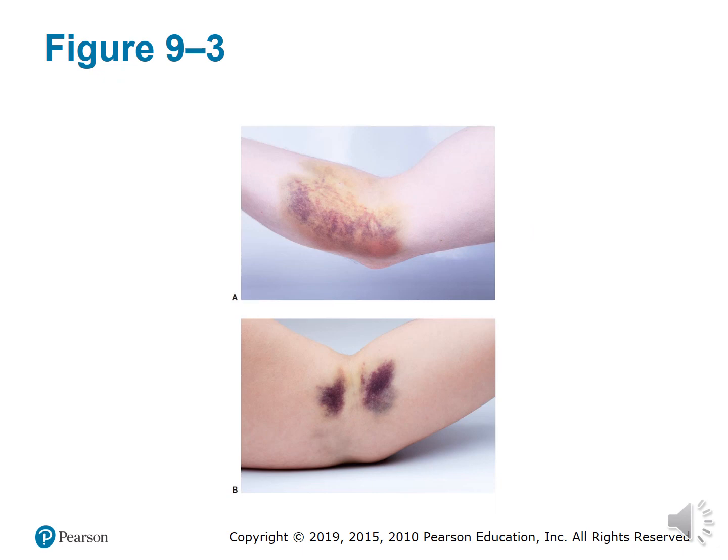Right. Here you see a hematoma, what it looks like once the area becomes bruised. Now, in the event that you see this on a patient, these two are fairly new hematomas. If the hematoma looks like A, you definitely don't want to draw, especially if this is the arm where the patient frequently gives blood and there isn't a viable vein in the opposite arm or anywhere else. Then we're just not going to collect blood from them. All right, that's a no.